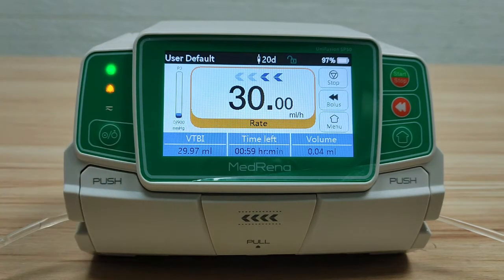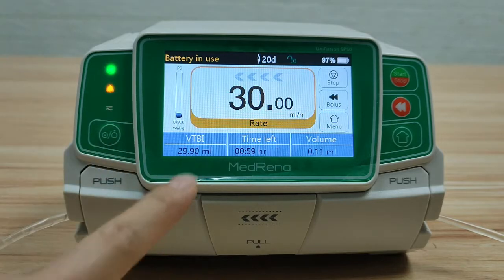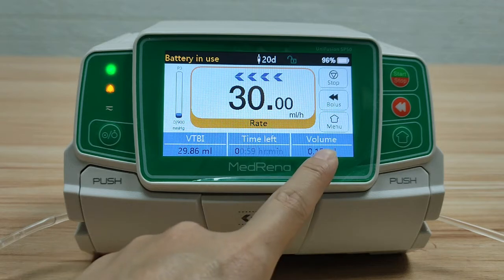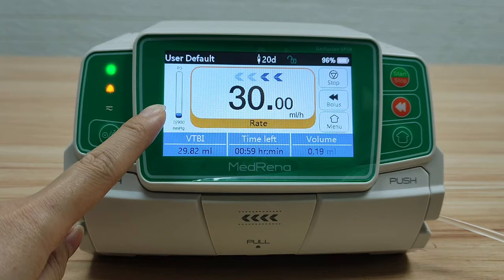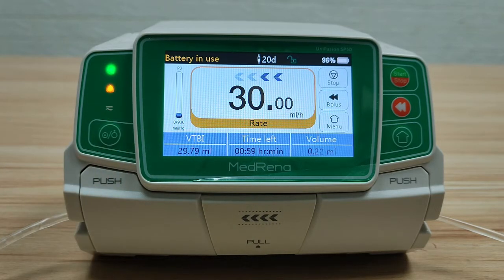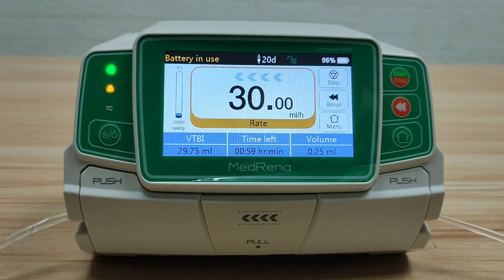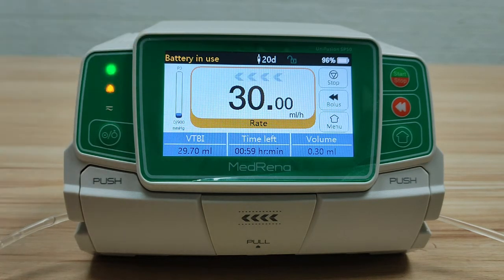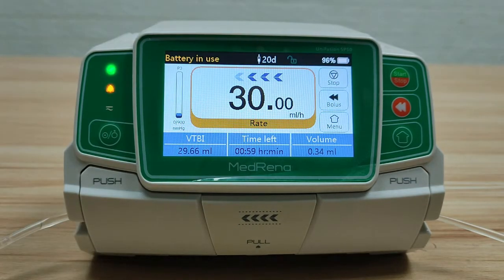This is the display when infusion is running. On the display it shows: infusion rate, infusion mode, volume to be infused, remaining infusion time, infused volume, and a pressure bar showing dynamic pressure status. The soft keys for Stop, Bolus, and Manual are also shown. On the title bar, it shows infusion set brand, battery in use, infusion set size, screen lock, and remaining battery capacity.